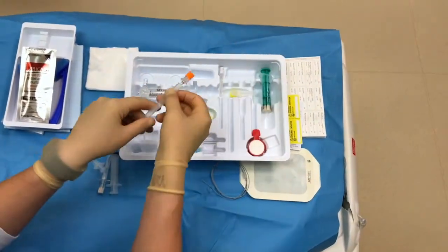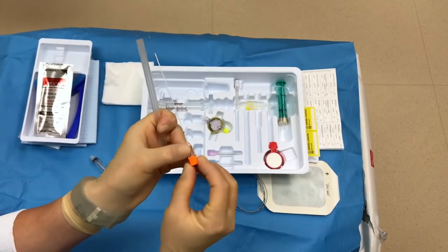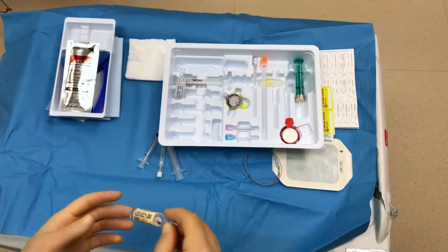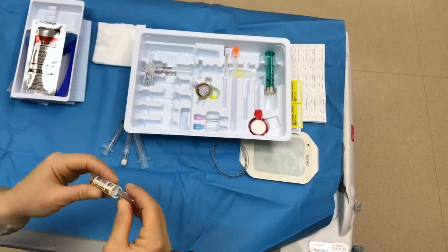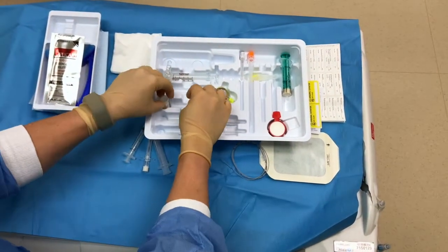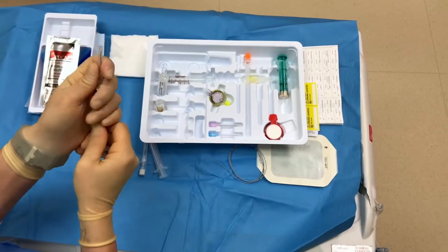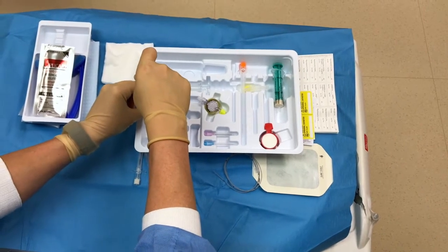Another syringe. All right. And then here's our spinal needle with our stylet. So I'll just show you how I typically set it up. I usually open up my lidocaine first. With this glass, the glass can break in fragments, can shatter onto the field. So I typically swirl and open outside of the sterile field and then place down. I typically use this 3 cc syringe with the filter needle to help draw up my lidocaine dose. So, I typically fill it pretty much all the way with lidocaine.